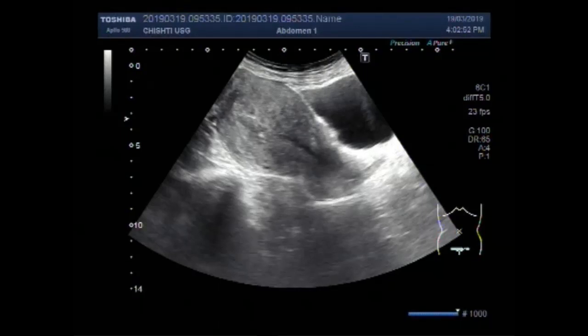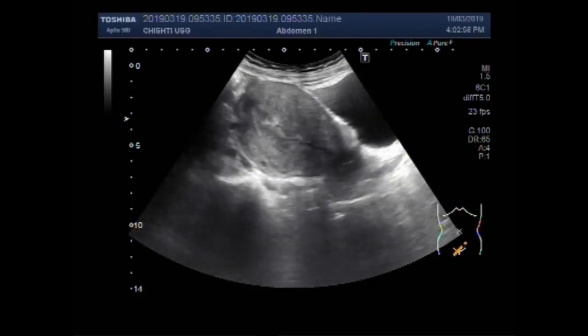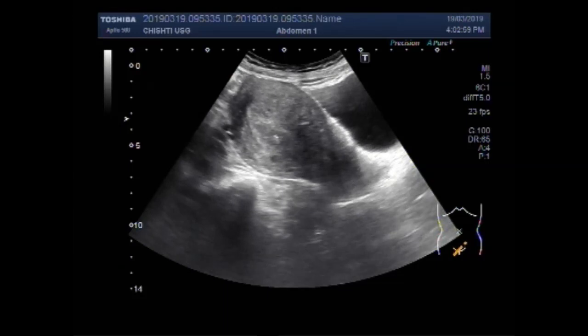Dear viewers, I hope you are all fine. This ultrasound video shows multiple findings in the uterus and ovary.